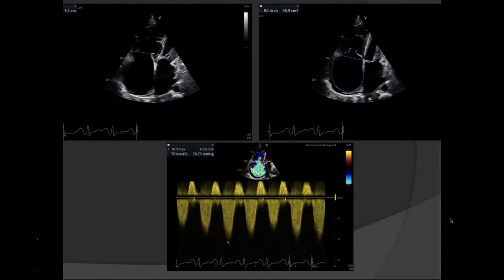Yeah. So I just wanted to tell, because if it is a sinus rhythm issue, you will be averaging it. But if it is because of excessive respiration, a person is very dyspneic, then you may find such kind of varied velocity difference. So this panel was showing very nice things, so I just thought, let me point it out.